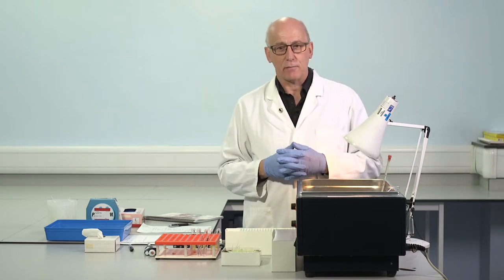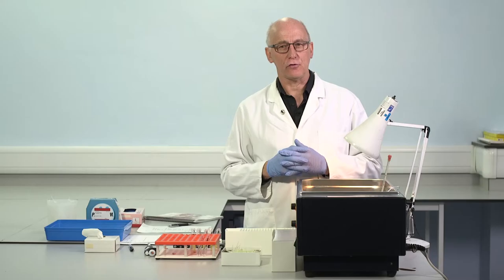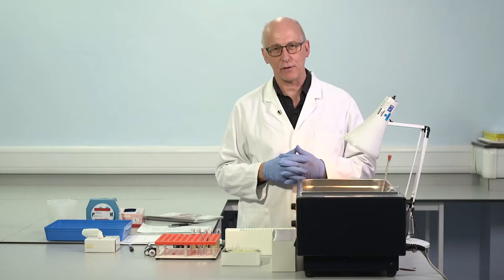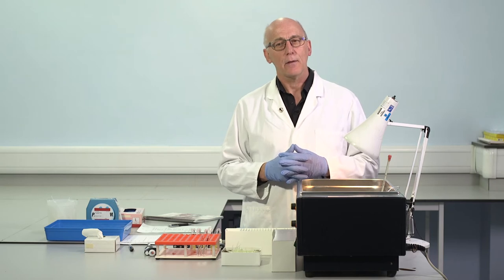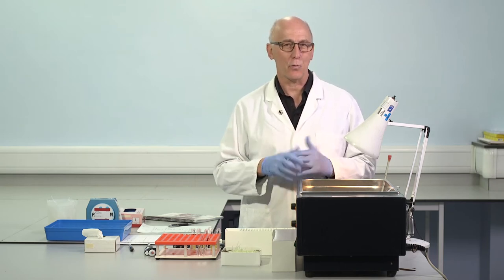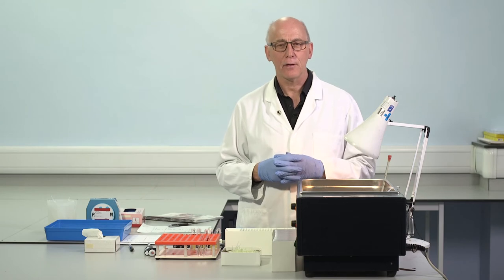The second reagent, as you know, I'm sure, for an APTT is calcium chloride. There's no absolute agreement on which concentration should be used. However, the vast, vast majority of reagent manufacturers and the vast majority of laboratories are using 25 millimolar calcium chloride. If you maintain a stock solution at molar concentration, that's a 1 in 40 dilution in distilled water. This is the most frequently used concentration.